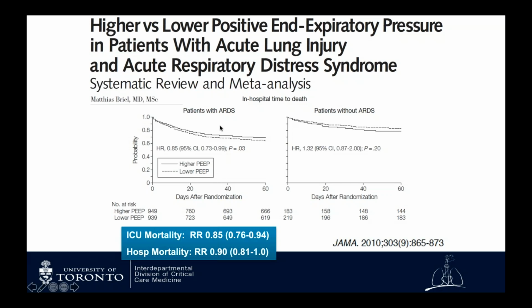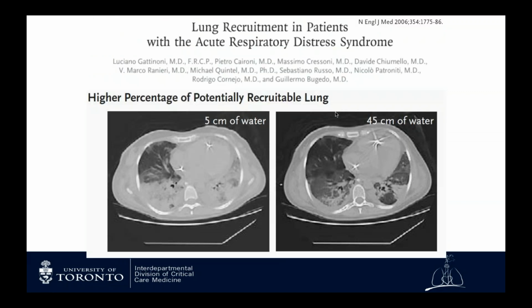So patients with what we'd now call moderate to severe ARDS, PF ratio less than 200, had a significant signal for improving mortality in the higher PEEP FiO2 tables, whereas patients with mild ARDS, PF ratio 200 to 300, not quite statistically significant, but if anything, the signal is in the opposite direction. And this gets back to the idea of tailoring your PEEP to the amount of recruitable lung that you have.